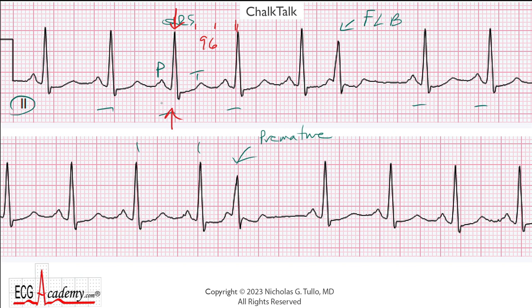What about the PR interval? Look at this beat. Notice that the QRS complex starts on this line right here. We can see the P wave starts around this line right here — four little boxes, so that's 160 milliseconds.